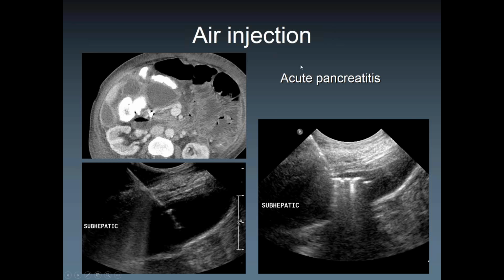And they're going to ask you to aspirate an abscess, and then you're going to find out why you can't. This patient here, for example, has acute pancreatitis with different pockets. This one was surrounded by a bowel. This one here was a little tricky too. So we ended up going after this one here. Here's a needle, but you couldn't aspirate anything. There was nothing that would come out, even though it looks very liquidy, right?